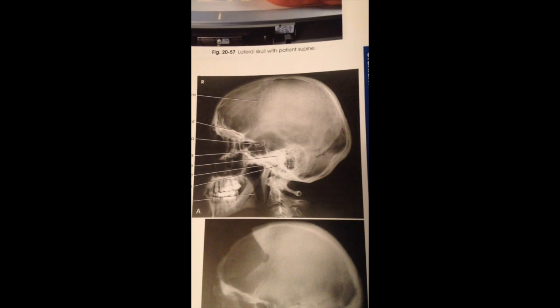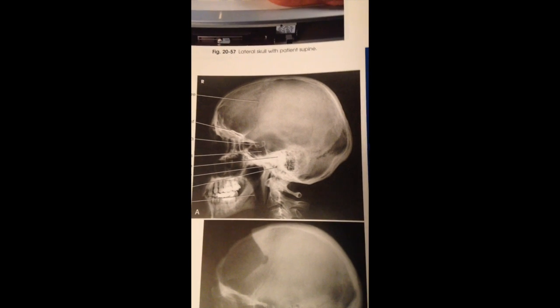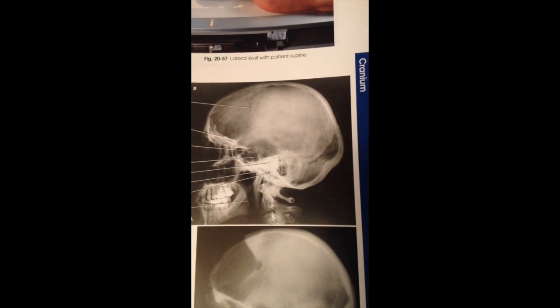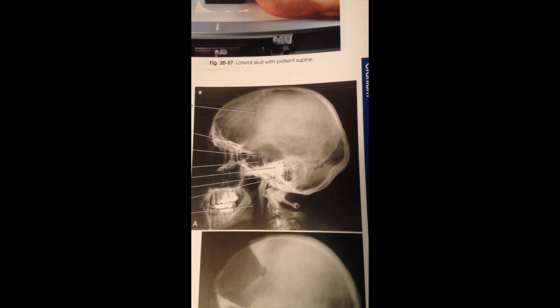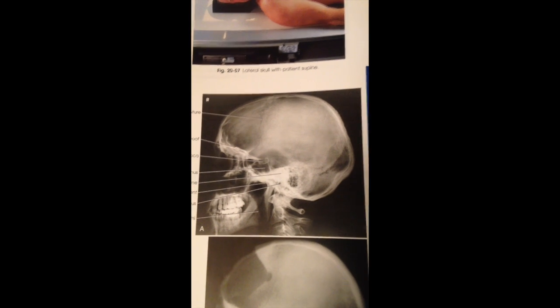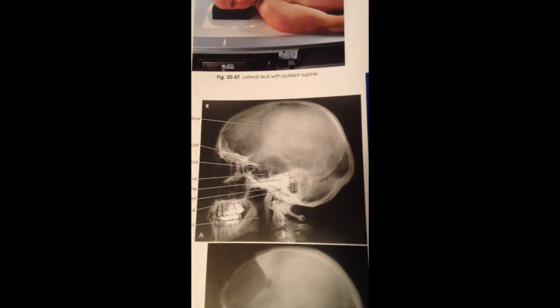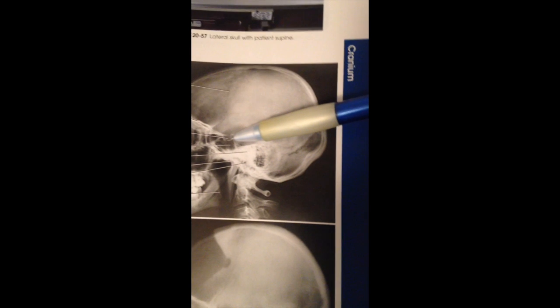So here is my lateral projection of the skull. It shows evidence of proper collimation. It shows the entire cranium without rotation or tilt, and it shows the superimposed orbital roofs and greater wings of the sphenoid over here. The sella turcica is in profile, right there.